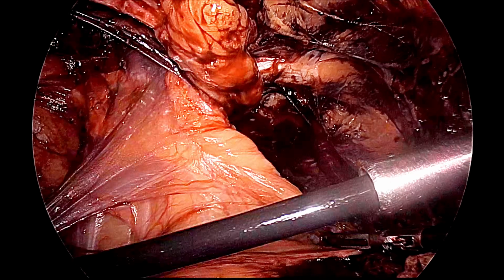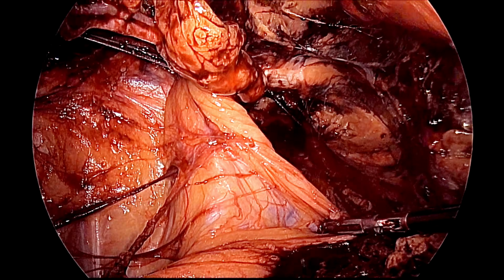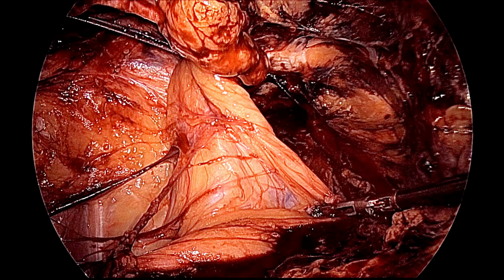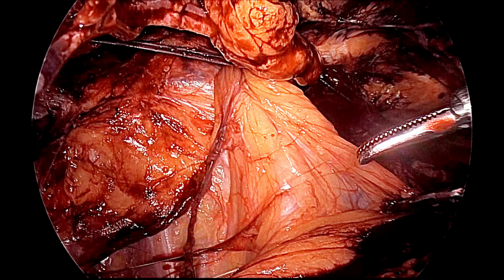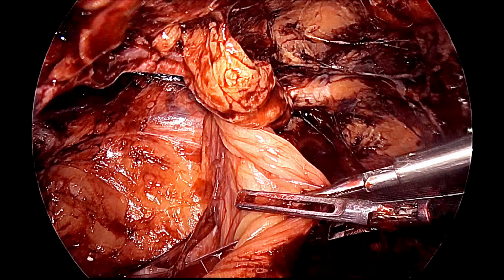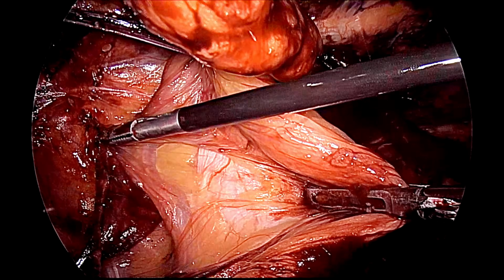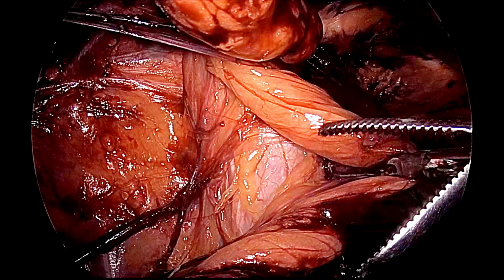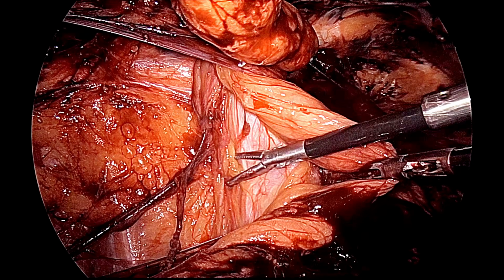Sometimes an assistant can also be useful to pull it. In the TAPP, the advantage is that we can pull the omentum very softly with the grasper, but here you have to push it down because we are preperitoneal. So, now slowly here we are separating, and in this area laterally you will get the spermatic vessel and medially the vas deferens. So, this is the area of the triangle of doom. We have to be a little careful.